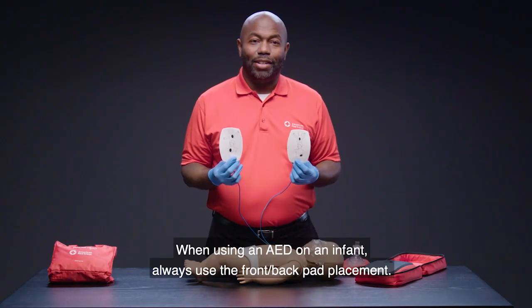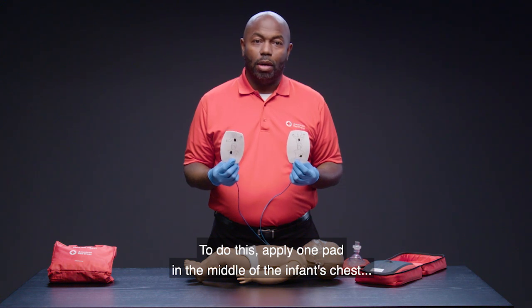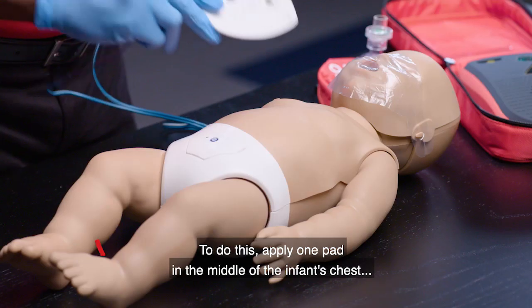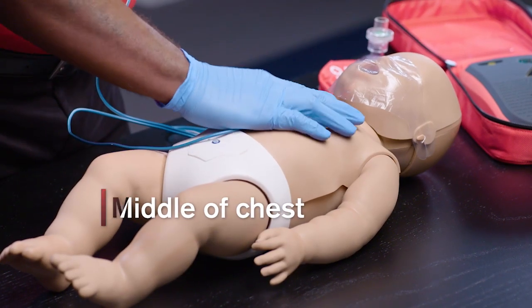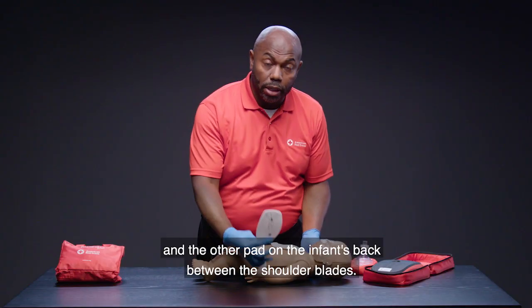When using an AED on an infant, always use the front-back pad placement. Apply one pad in the middle of the infant's chest and the other pad on the infant's back between the shoulder blades.